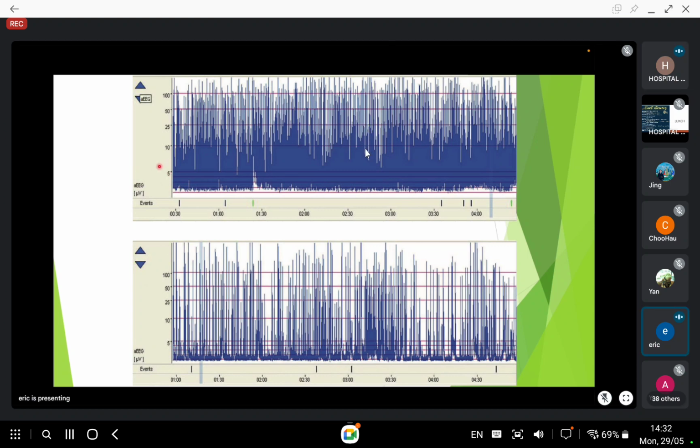So like I said, you want the band that is most dense, right? So you can see that this is actually the band that is most dense. It's actually just at 10 and below. Okay. So this is actually burst suppression. So yeah, this is also burst suppression. This is also burst suppression. Oh, okay. Yes. This is the more severe one.